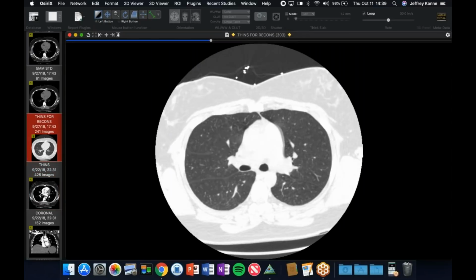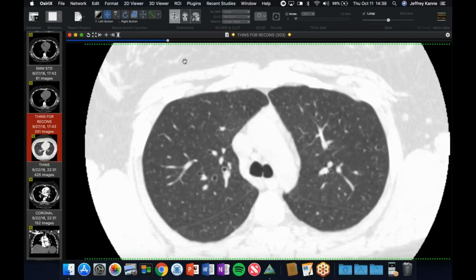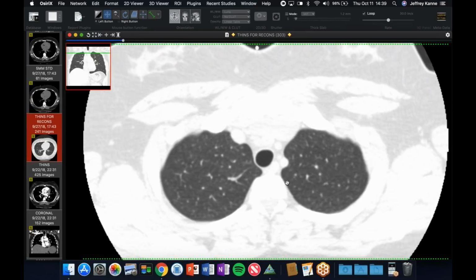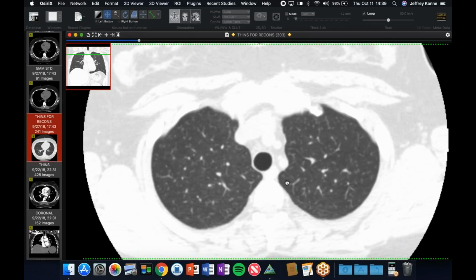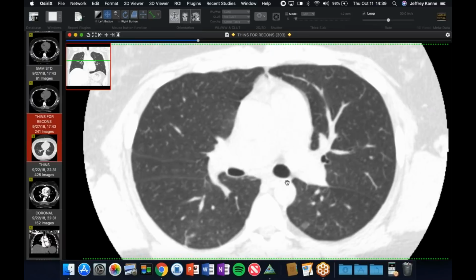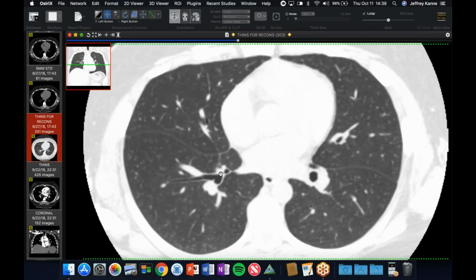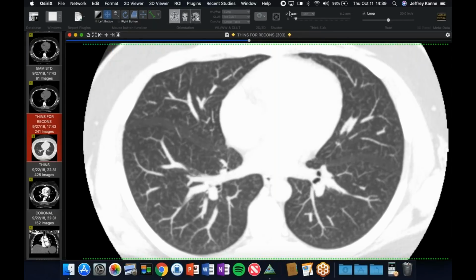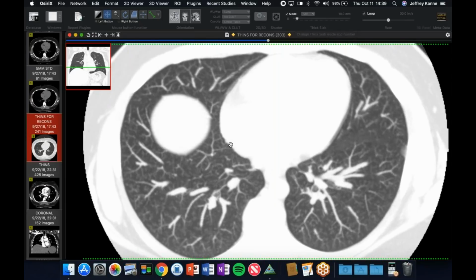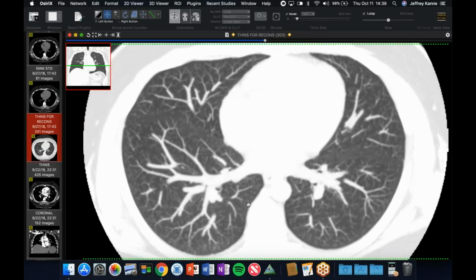And here's a different CT, but just from 5 days later, but it better shows the lungs, and I'll make some MIPs in a second. If you look at her lungs, I think you can start to see there's a bunch of little dots that aren't vessels, but tiny little, almost miliary type nodules, but not quite randomly distributed. We don't see them along the pleural surfaces, along the fissures. Now I'm going to switch over to the MIPs here. Let's thicken this up a little bit, about 8. And as I scroll, you can see there's all these just tiny little nodules in the background.